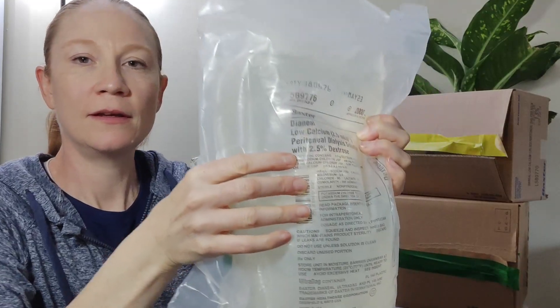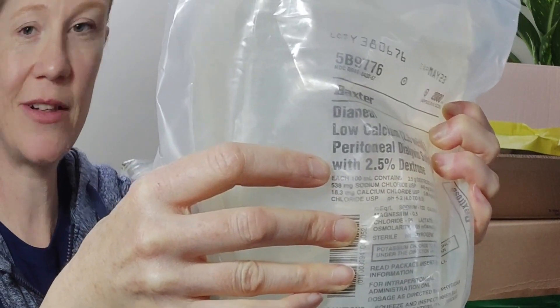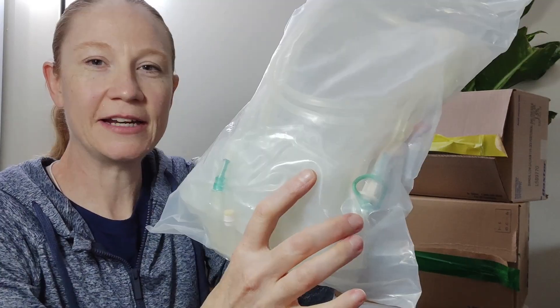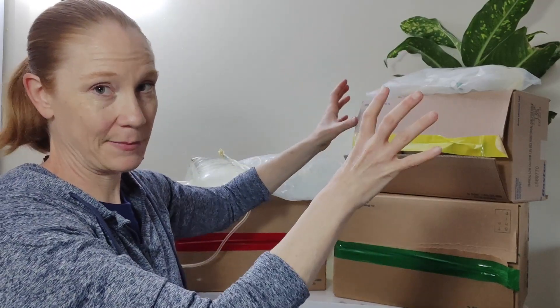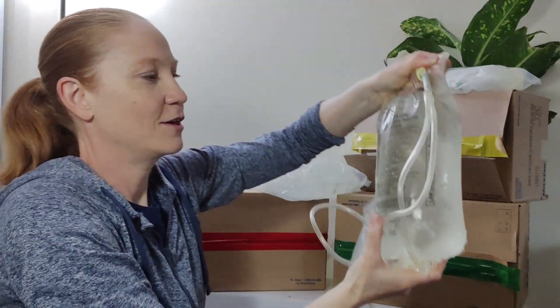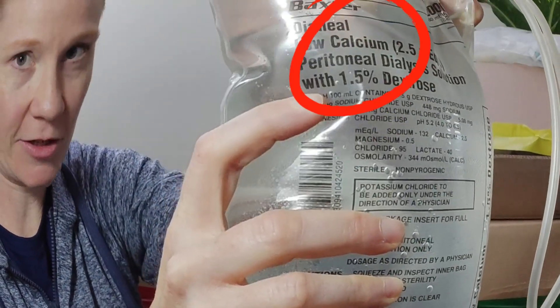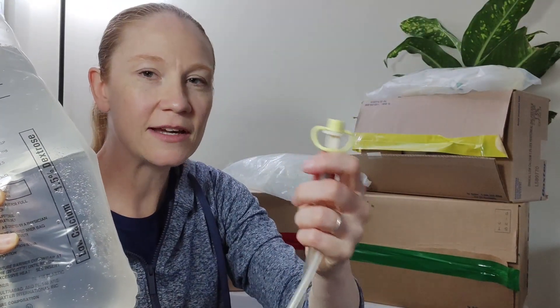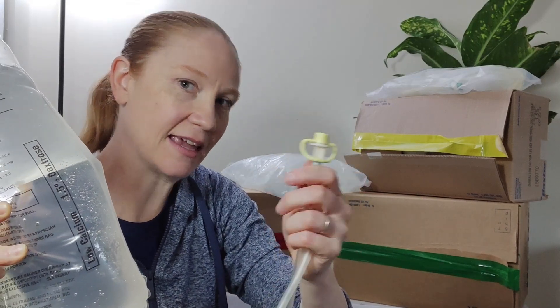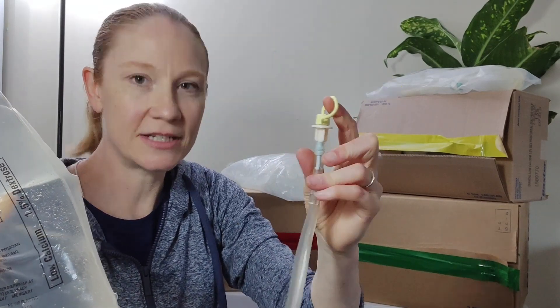Now I'm going to show you what a bag looks like. This first one is a manual bag. You can see that it is a 2.5% dextrose and its coordinating color is green. Let's check the rubber seal to see if it's green — and here you can see that it is green. The next bag is also a manual bag with 1.5% dextrose, so this should be yellow. You can see right here on its rubber seal it is yellow. So you're not going to accidentally mistake a red for a yellow or green, because every time you pull off this rubber seal to start therapy, you're going to see what color it is.